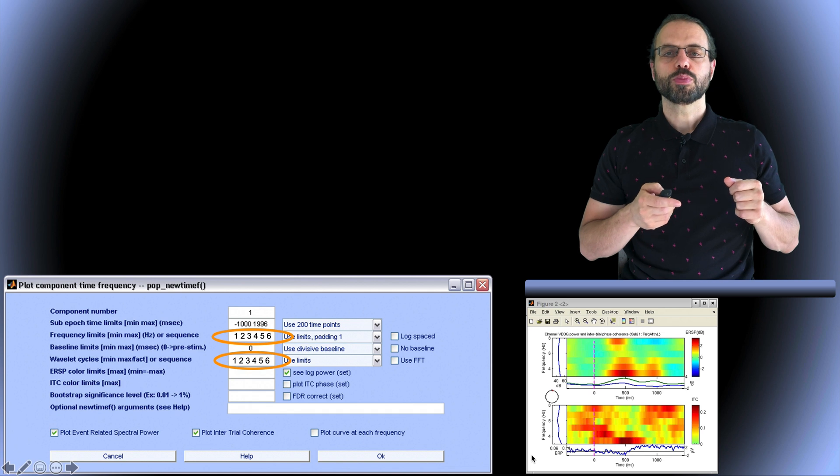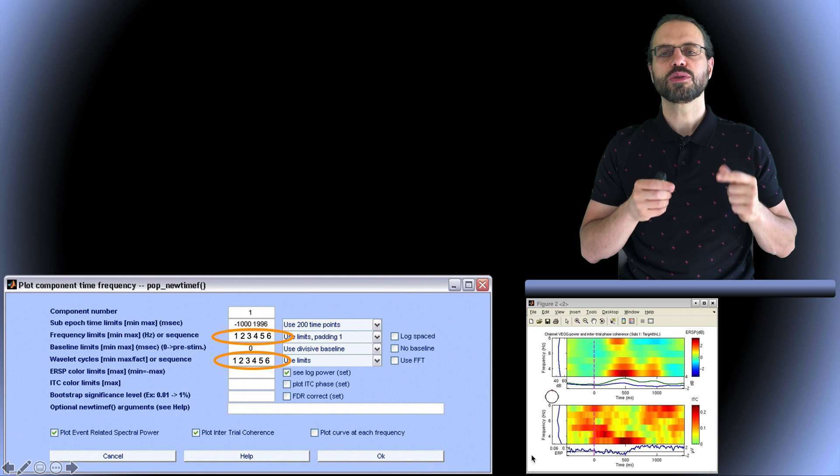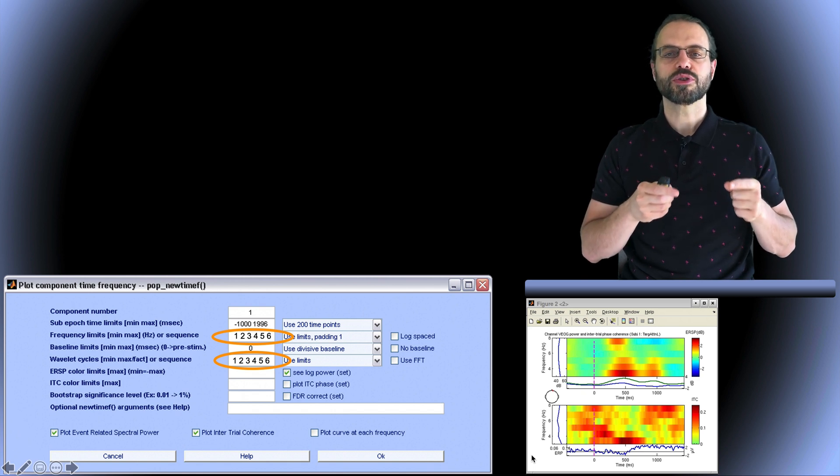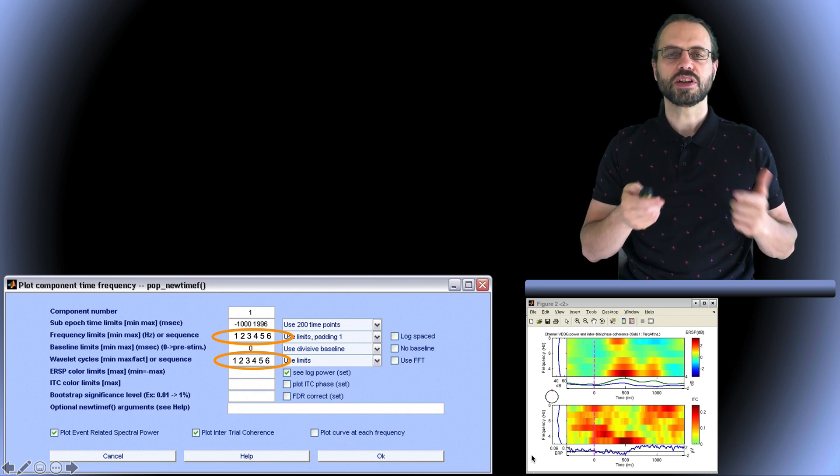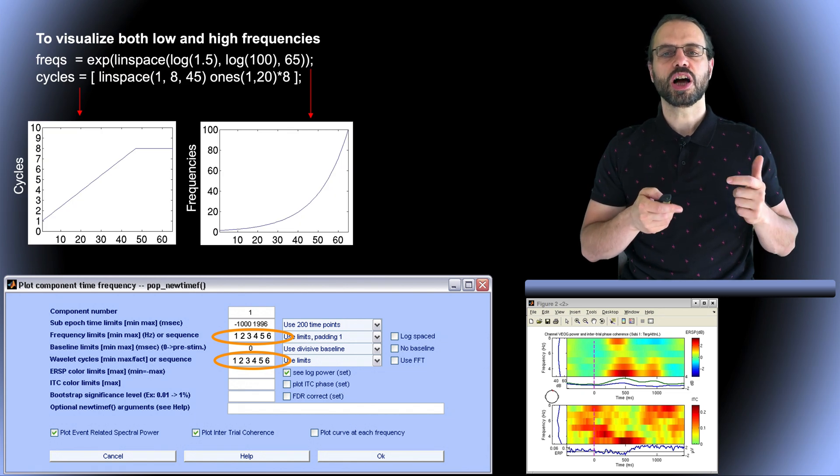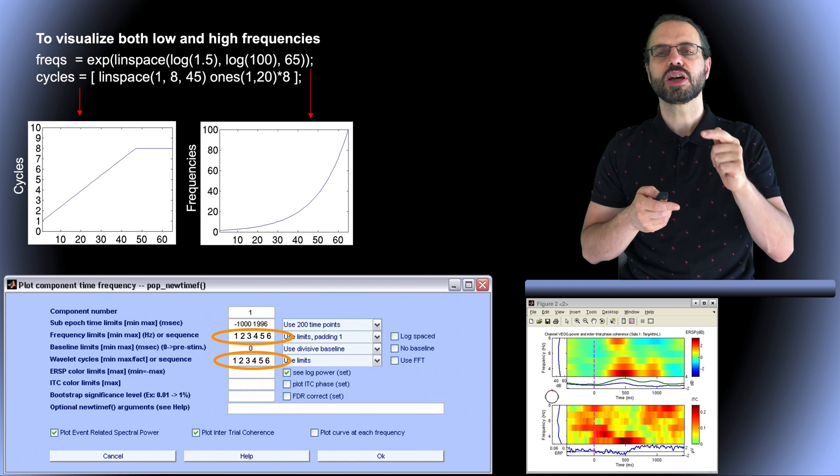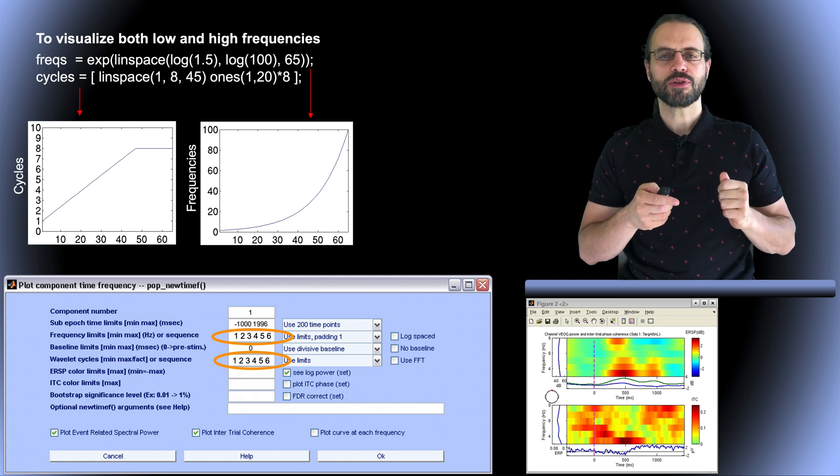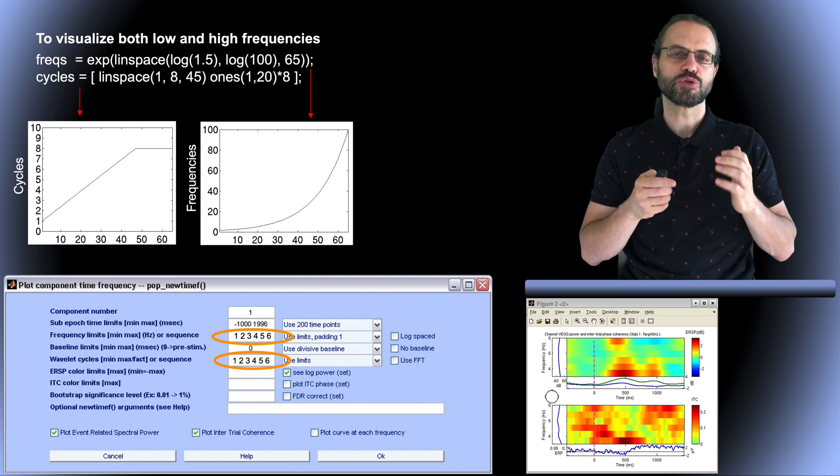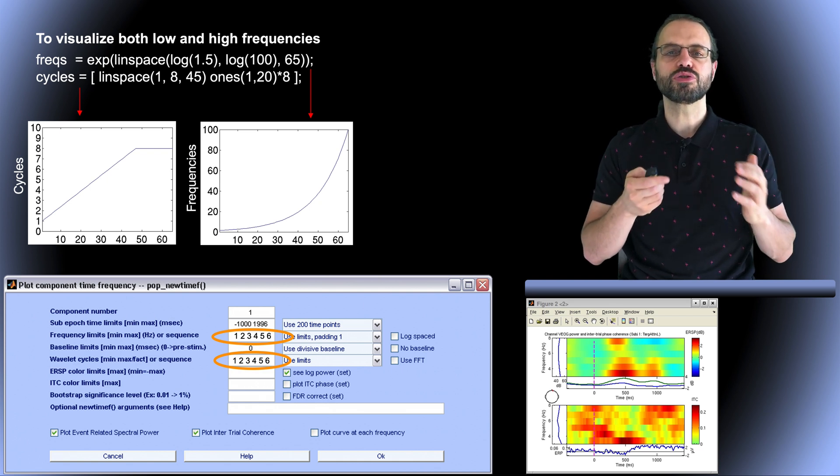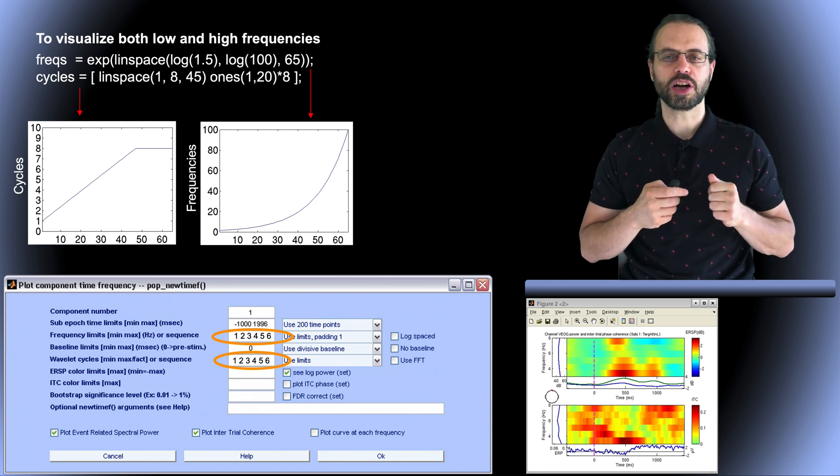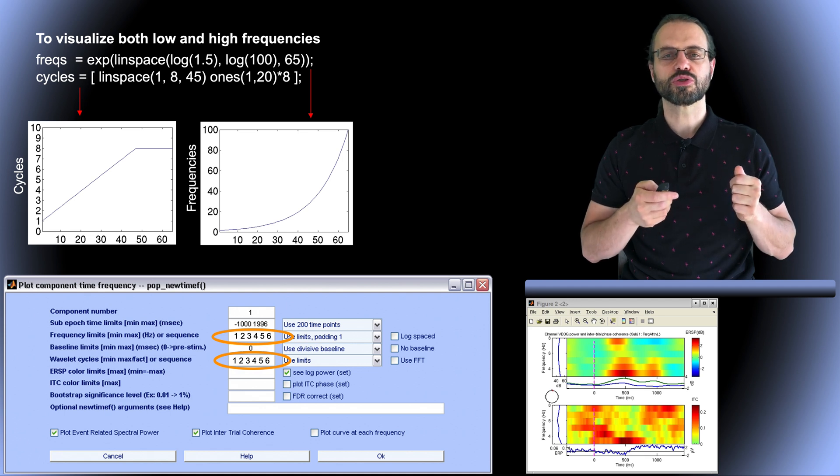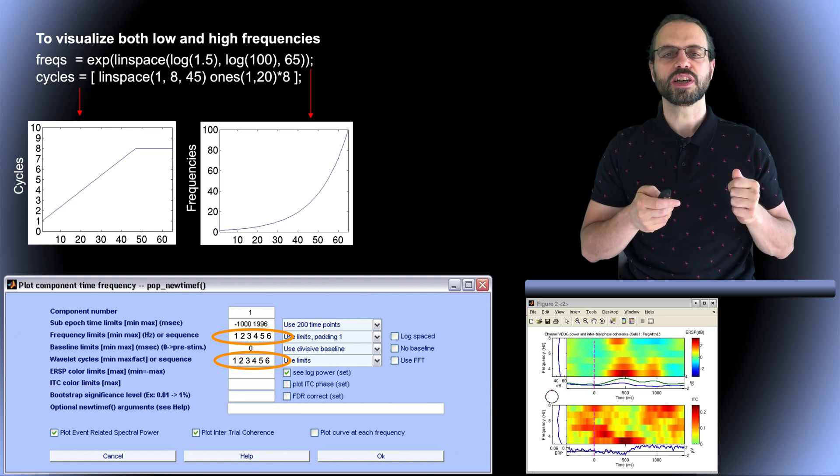Finally, it's also possible to use custom frequencies. For example, here I selected frequency 1, 2, 3, 4, 5, 6 Hz and the same number for cycles. This is arbitrary, so I do not recommend to use this value necessarily. For publication purposes, I usually use log-spaced frequencies and linear increase in the number of cycles, which I cap to 8 above 45 Hz. I cap the number of cycles at 8 because most articles use 8 or sometimes 12 cycles wavelet to study high gamma band power, so it would not make sense to continue to increase the number of cycles above 45 Hz. If you want to use the same parameter, you can simply copy and paste these two lines in your script or copy and paste the values in the edit box in the graphic interface.